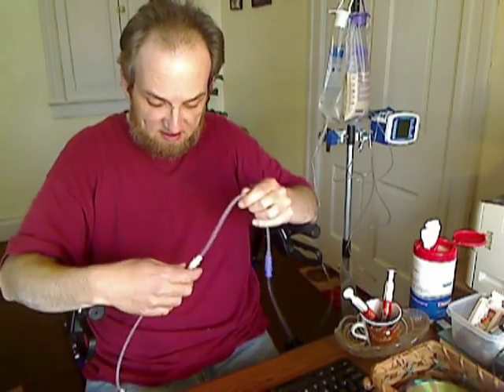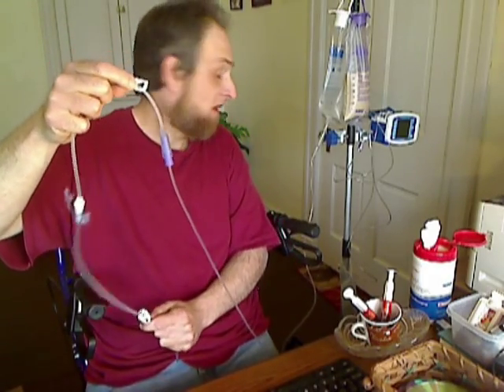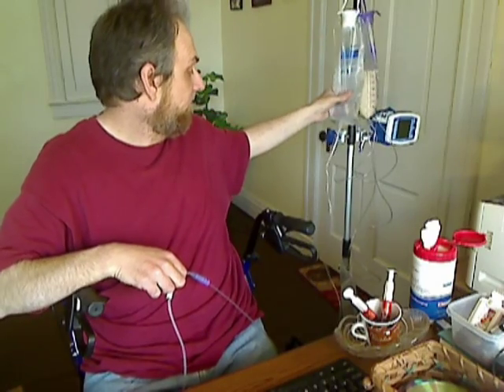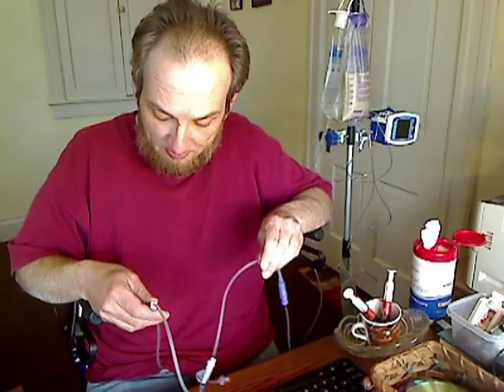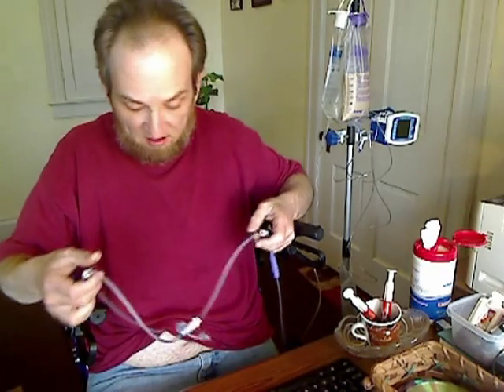Now what I do is I open my water, and I open my stomach, and now we are flushing. You can see it's flushing. So what I want to do now that I've flushed, you always flush before your medicine when you first put it in, 10 to 30 cc's of water. I've now flushed it, so I'm going to go ahead and close the water clamp. I'm going to close the feeding tube, stomach clamp.